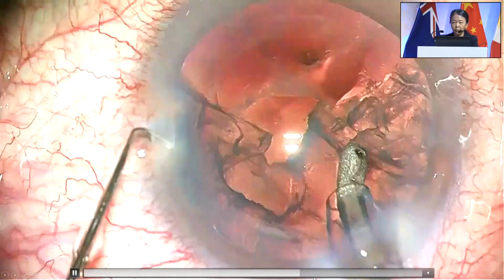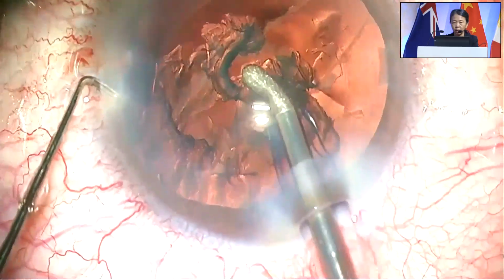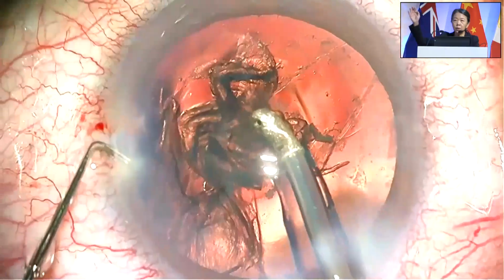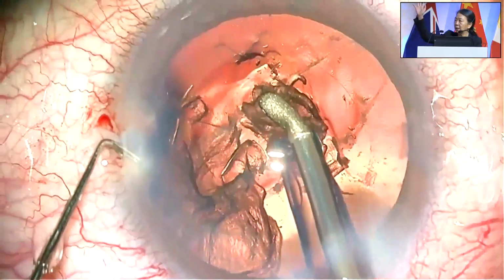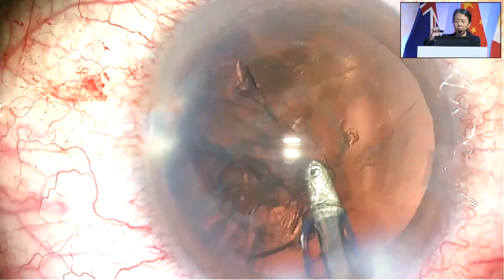So how many of you would go ahead with a trifocal lens? In this case, it's non-toric. How many would go ahead with that? One hand, 2 hands, a few hands. Okay, definitely not the majority.